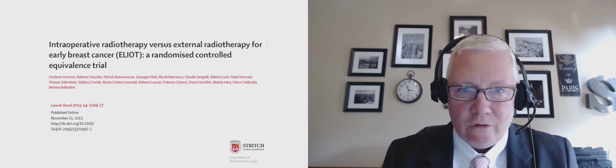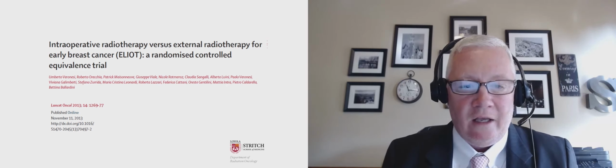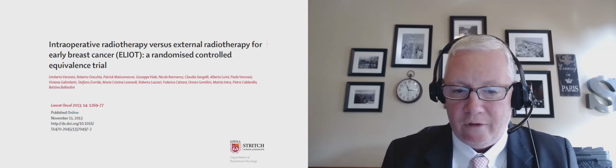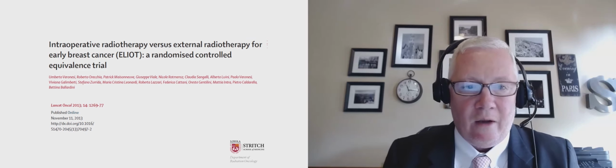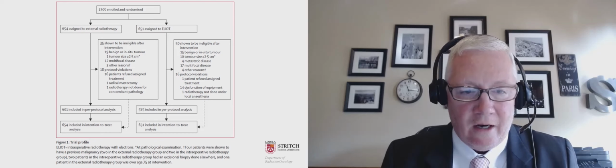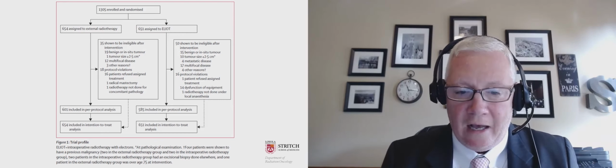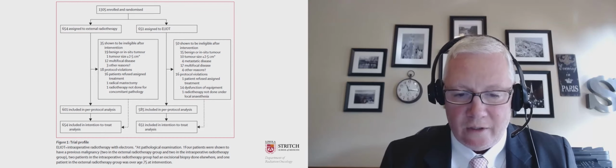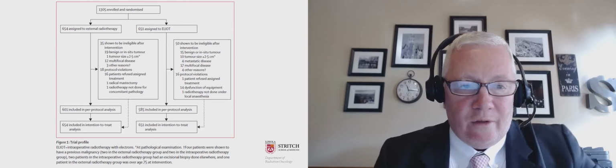So there's some really interesting quality of life, health disparity, cost, and other avenues that seem like this might be an interesting thing to do. So this trial used an electron therapy. I won't bore you too much with the details, but 1,305 patients were enrolled. They were randomly assigned between the single dose of intraoperative radiation versus standard daily radiation for about 4 weeks, after 3 to 6 weeks, depending on how the course was given after the surgery. It was a significant trial in the sense there were over 1,300 patients.